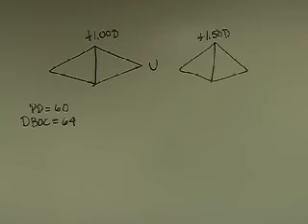Basic Optical Concepts, Unit 15 demonstrations continued. Here we have another example of verification, and when we verify the patient's PD with the DBOC, we ended up with the same 4 millimeter difference between the two. Now, again, the question is, how much prism does this induce, and does that meet the tolerance, or do we send that job back to the laboratory?